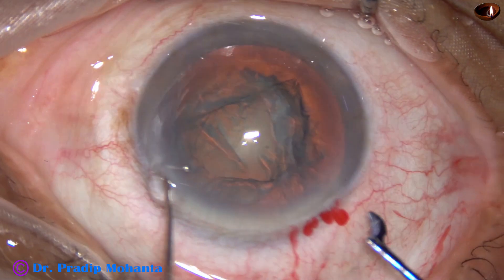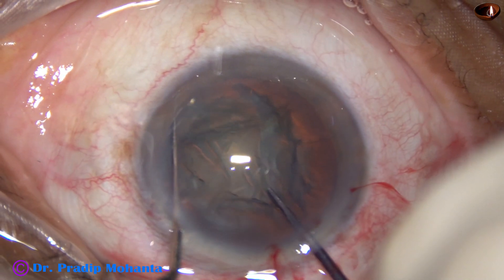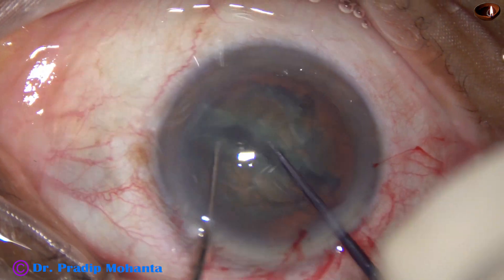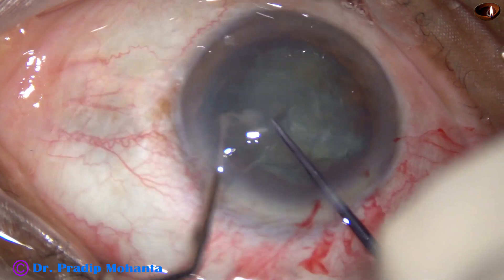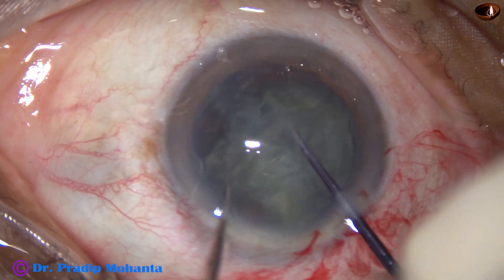This is the second case. The pre-chopper goes in, the sustainer supports the nucleus, and both instruments come towards each other. In this case, I could divide the nucleus into four pieces.